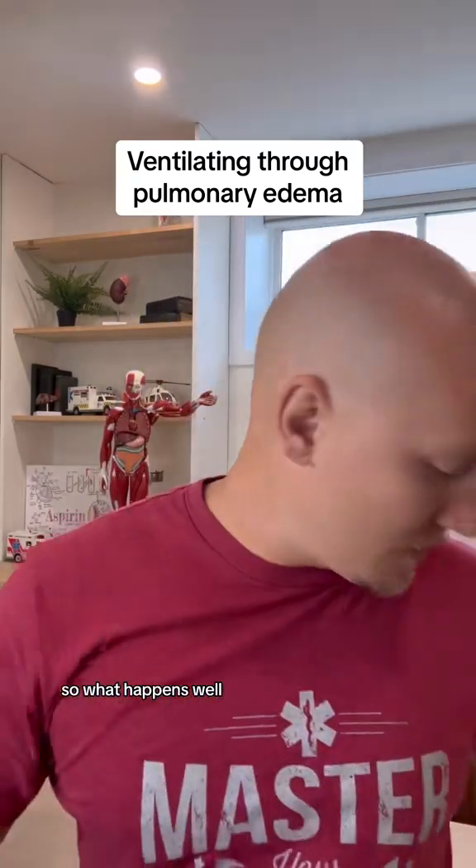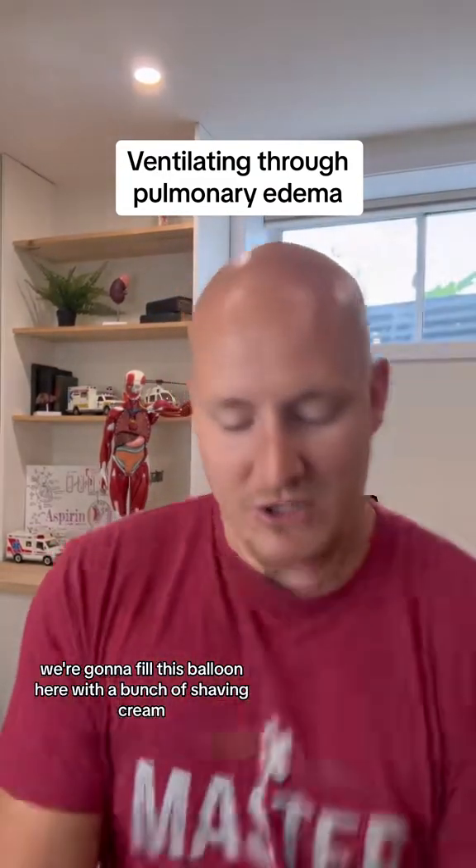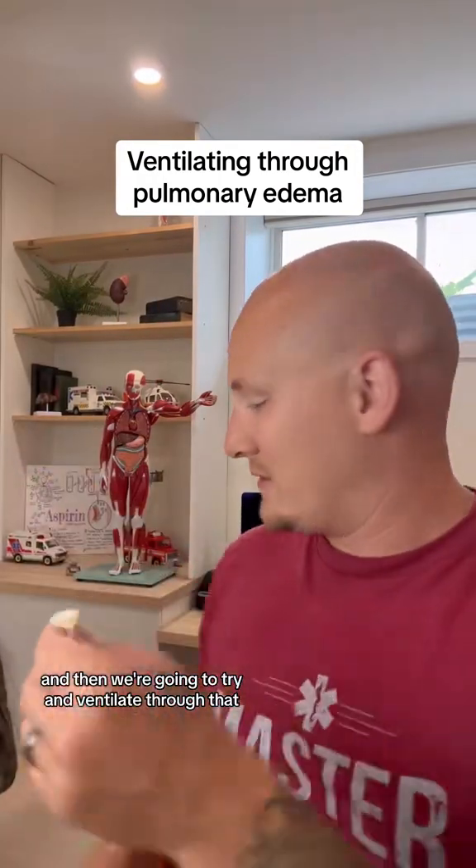So what happens? What we're going to do is fill this balloon with a bunch of shaving cream and then try to ventilate through that.